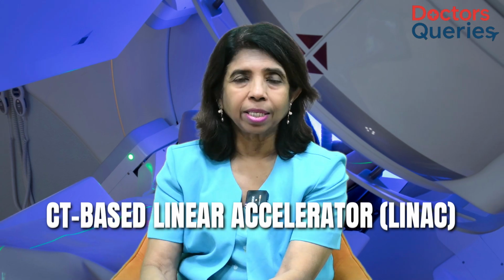So, most of the radiation machines which we have in India and abroad are CT-based linear accelerators. We have MRI-based linear accelerators too, but about this we are going to talk sometime later. Let us talk about the common linear accelerators which we have.